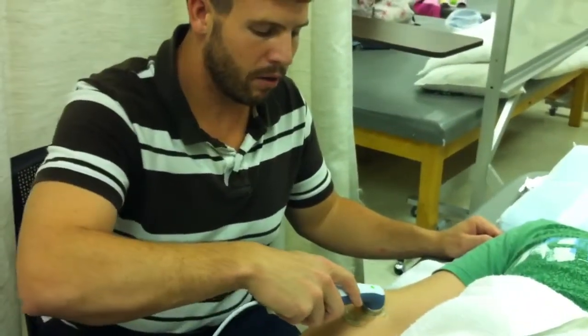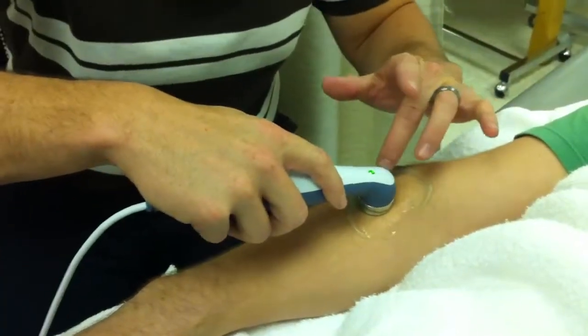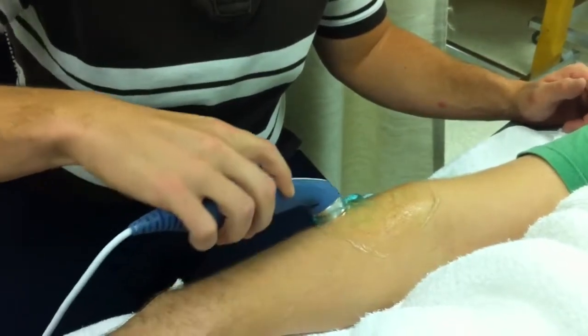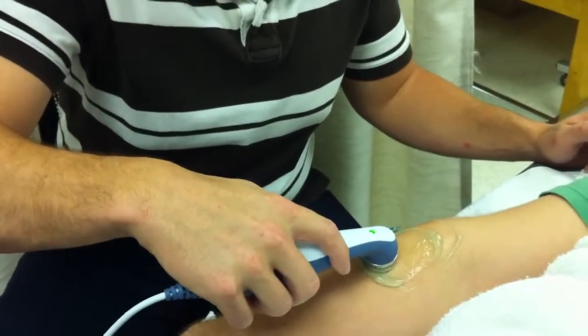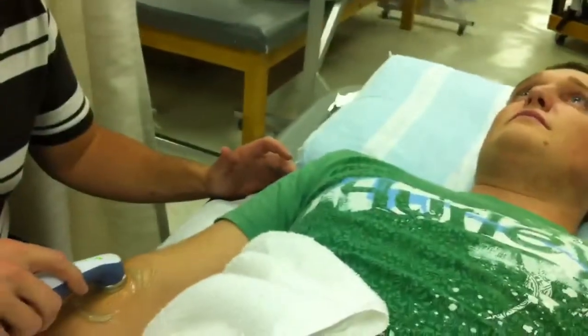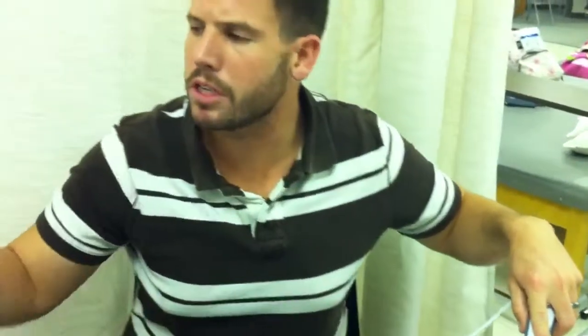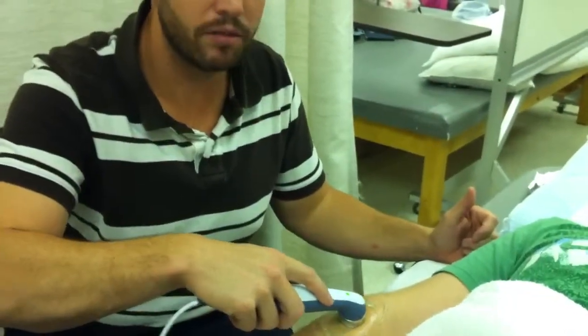Go ahead and hit start to begin your treatment. You want to move no faster than four centimeters per second, and the area you're treating is approximately two times the size of the sound head. Keep your eye on your patient, make sure you don't leave it in one spot, and always keep a good amount of gel underneath. You're always going to be asking them how they feel — if they have an intense burning, move it a little faster. You can also change the duty cycle; for example, at 50% it only heats half the time, cycling on and off, which will avoid it getting too hot.